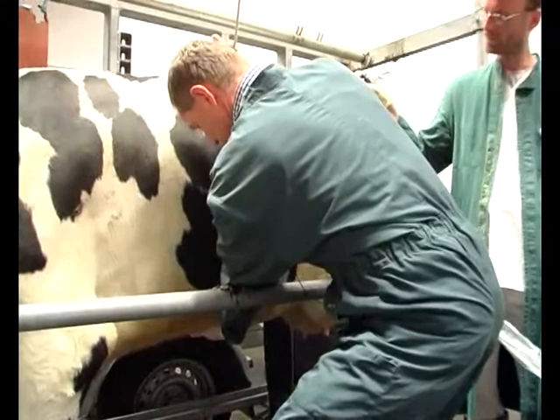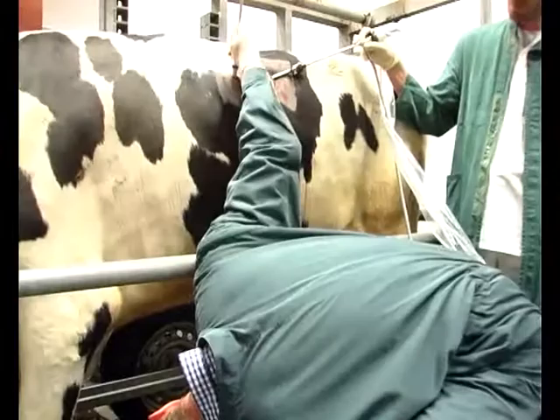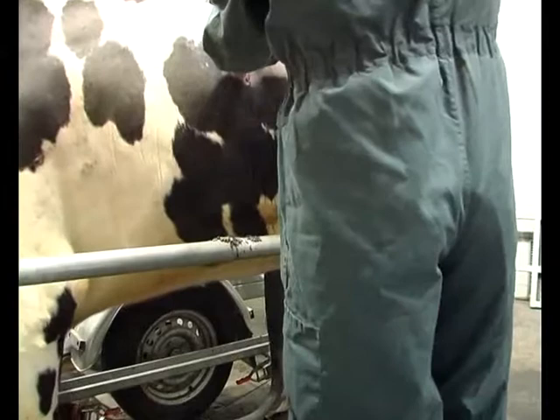Yes, I'm still in contact with the tip of the applicator. And now I'm on the right side. Position. This is more solid. I just give a small turn. Don't hit the needle, just push. And now it kicks on the right side. So, it's through the skin.